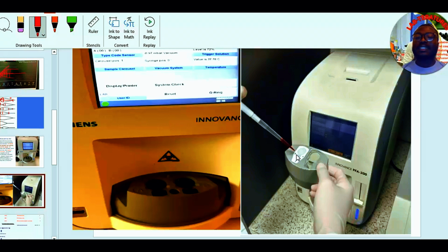So collagen is a universal agonist you will need. Now your next point is to analyze if the platelets are not properly activated to seal your injured tissue. Does it mean it is the epinephrine that you are deficient, or it is the ADP that you are deficient, because definitely collagen will be available. Therefore, in the sense of these manufacturers, they have two cartridges for each test.